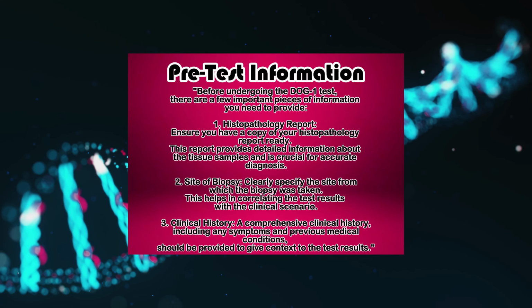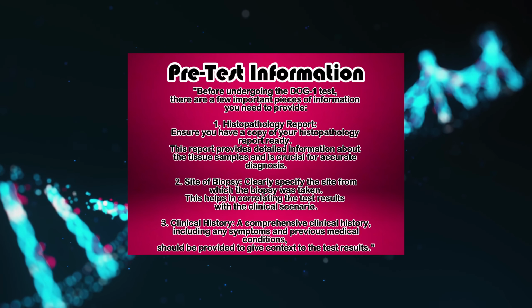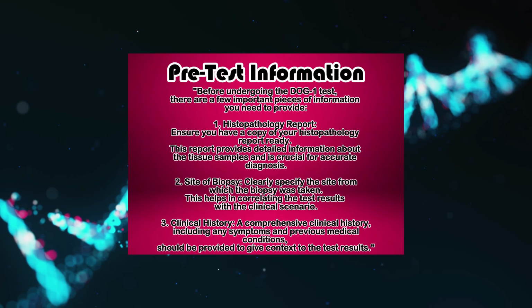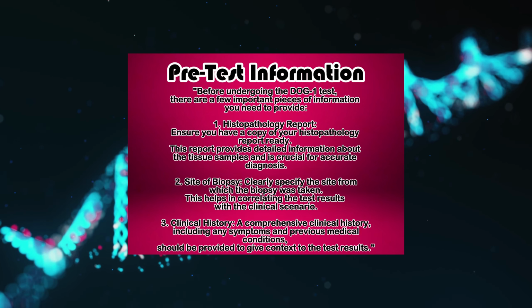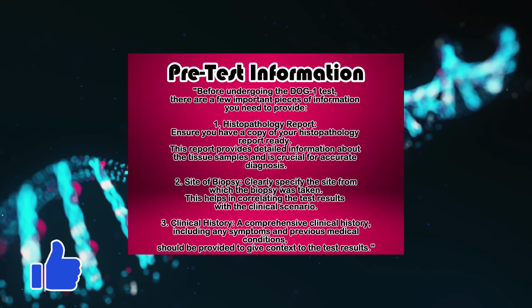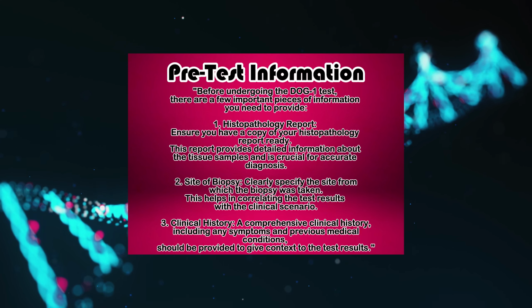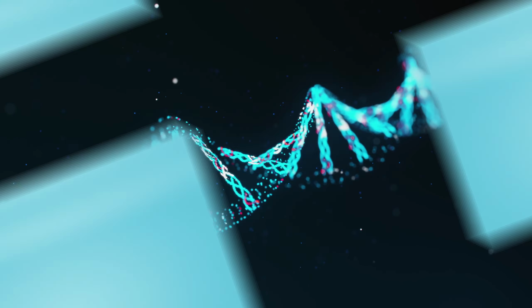2. Site of biopsy. Clearly specify the site from which the biopsy was taken. This helps in correlating the test results with the clinical scenario. 3. Clinical history. A comprehensive clinical history, including any symptoms and previous medical conditions, should be provided to give context to the test results.